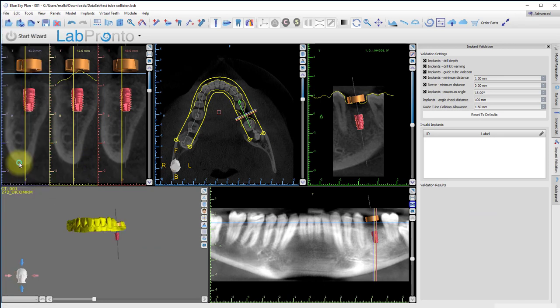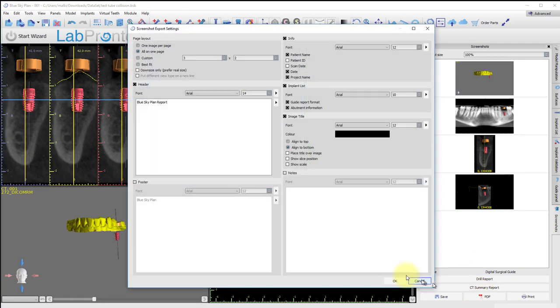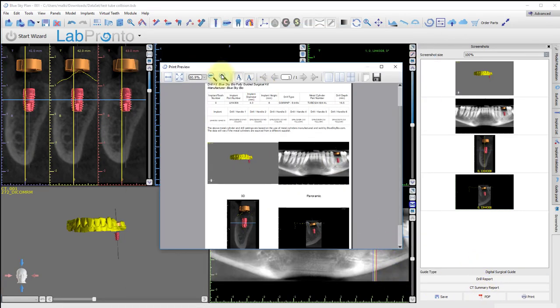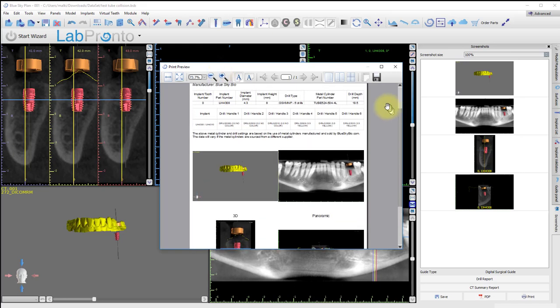Click Drill Report. In the screenshots panel that opens, click PDF. Click OK to confirm the format, and we zoom in. We'll see that the new drill depth is 18.5 millimeters.